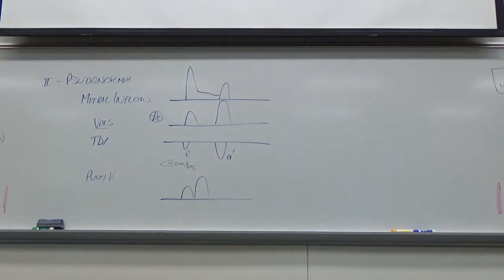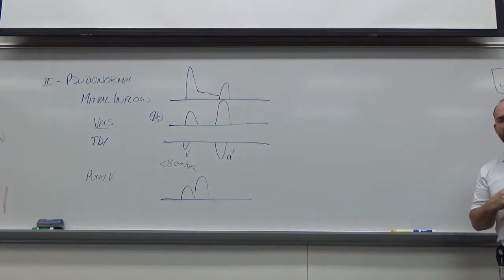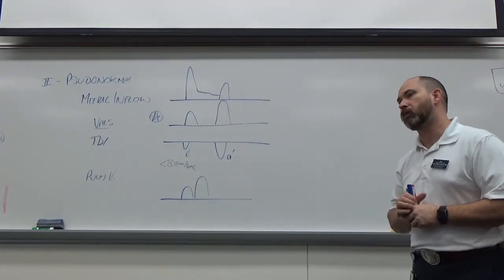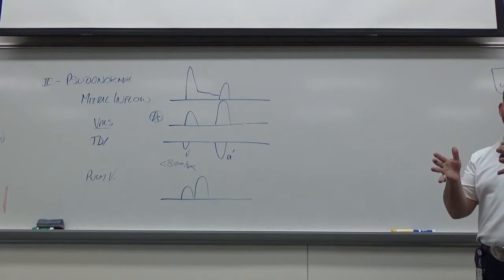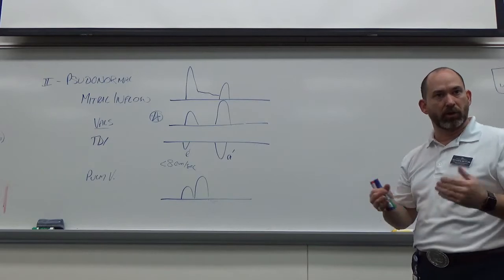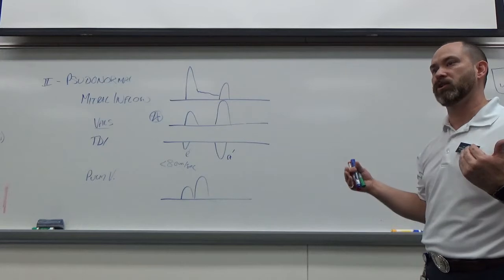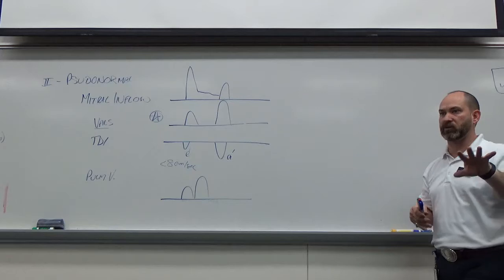With the numbers for the propagation velocity, do you want us to know what's based out of what you say is at the ASE chart? Generally speaking, I'm going to try to get everything out of ASE because that's our standard for most of our echo sites. There might be some variation. Don't be thrown when you go to clinical if they use different numbers. As long as that lab uses the same numbers for all their studies, you're fine. They may change, and each year they do studies that change what they think the parameters are. So you'll see numbers change over time, and that's okay.